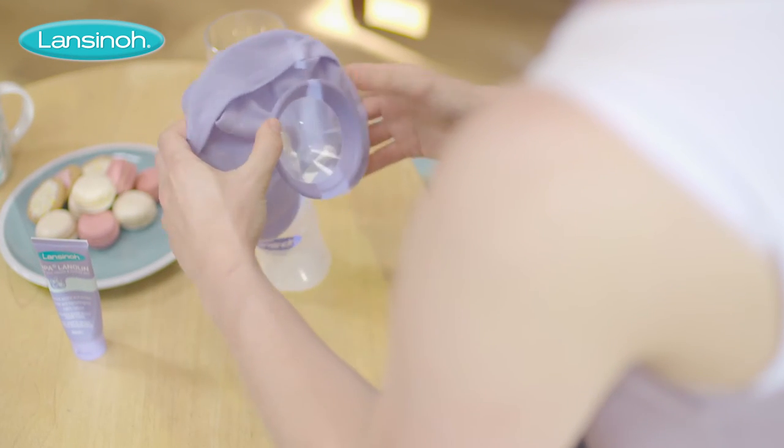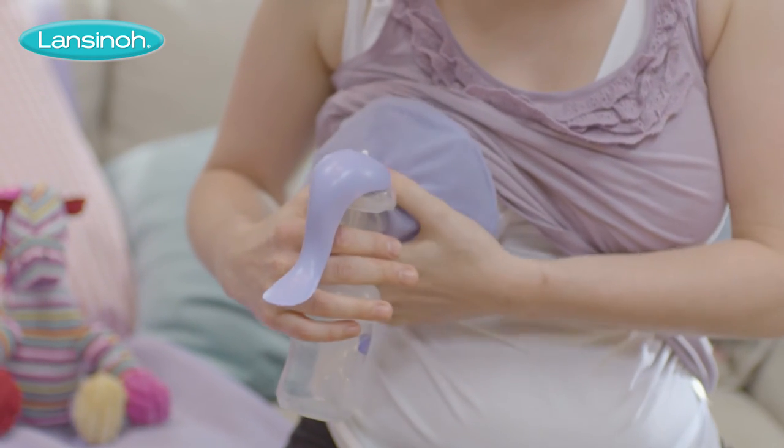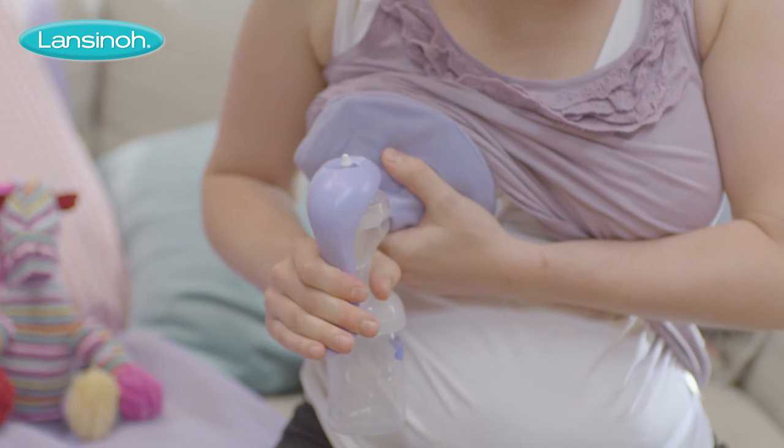When used warm, it's also the only product of its kind specially designed to work with any type of breast pump to encourage let down and reduce expressing time.